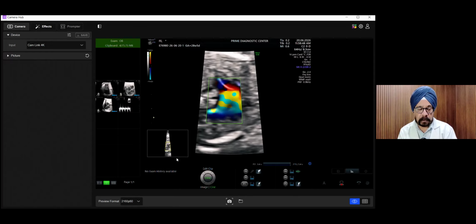I would think about any abnormalities missed in case I don't do sagittal views, and maybe come back to you on that. But one abnormality which was very nicely pointed out is that a sinus venosus ASD would always be missed if a bicaval view is not seen. So we would start adding a bicaval view at least in the extended views. The ductal arch and the aortic arch, I don't think they help me in any way.